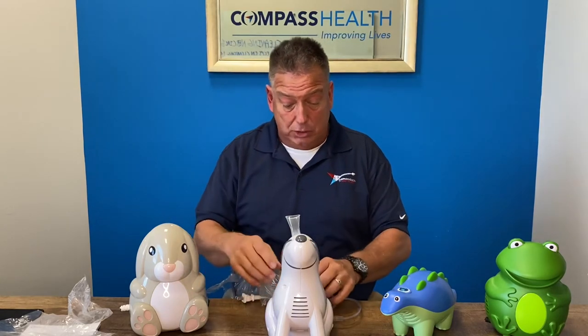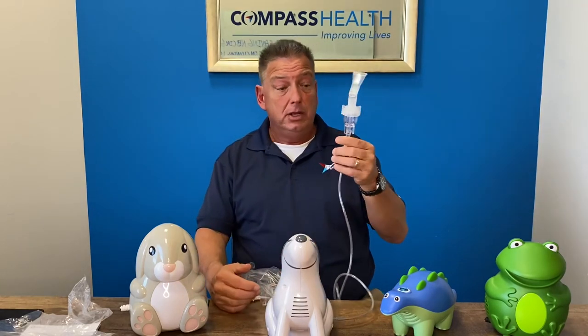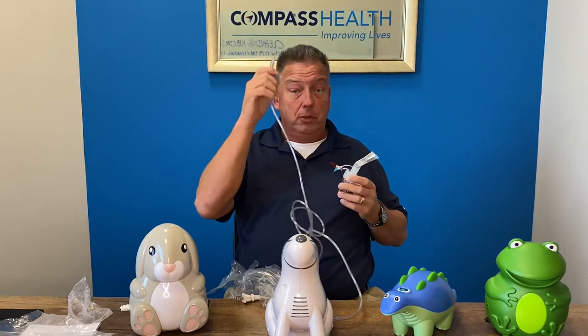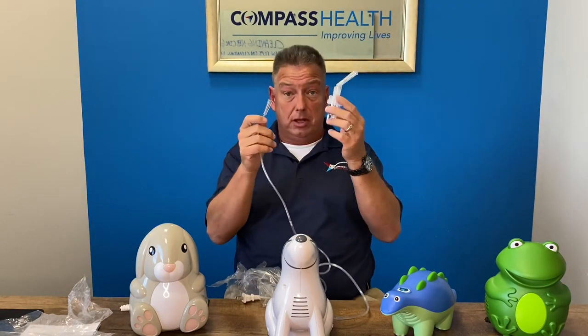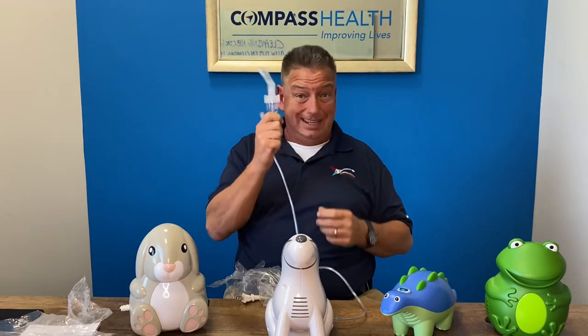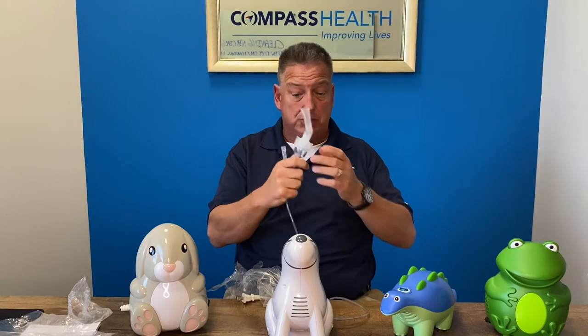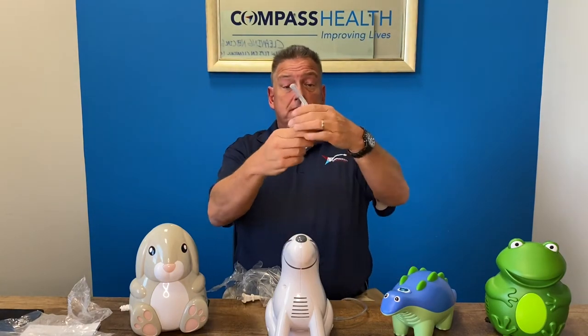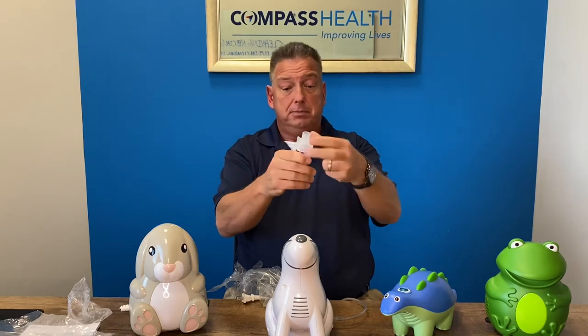As far as cleaning your disposable medicine cups, you never want to wash the tubing. The tubing will be replaced when the medicine cup is replaced, which we recommend every two to four weeks as long as you clean and maintain it after every use. After each treatment, you will take this apart and take each piece off.